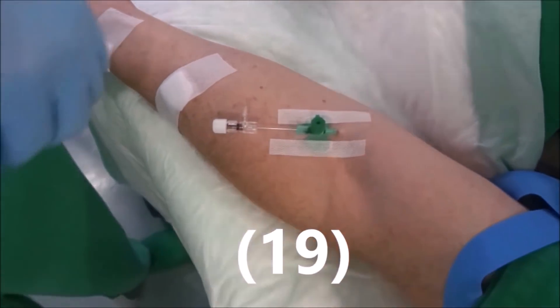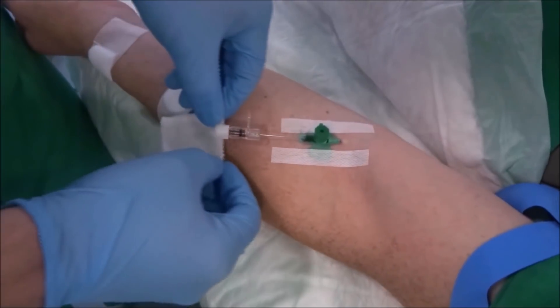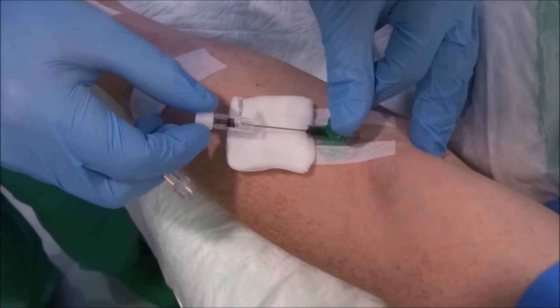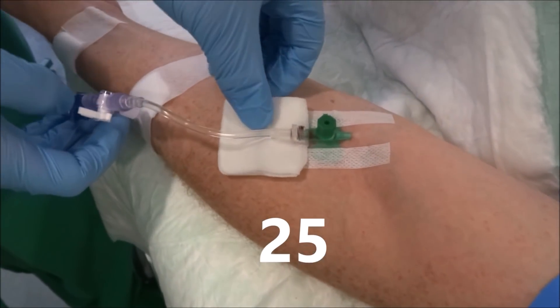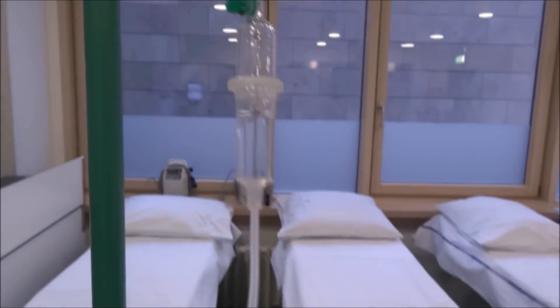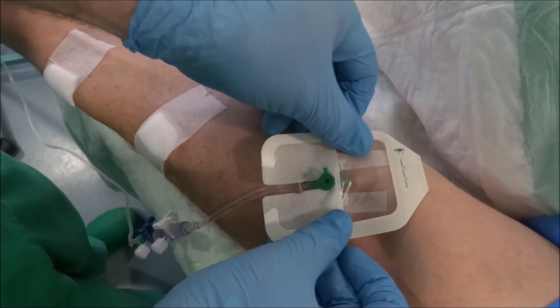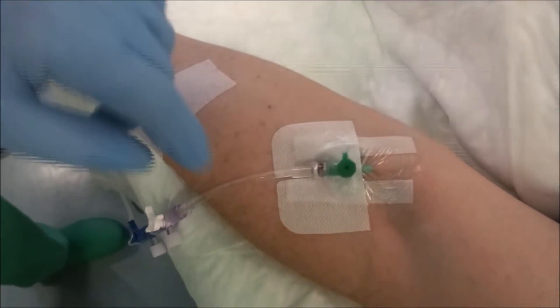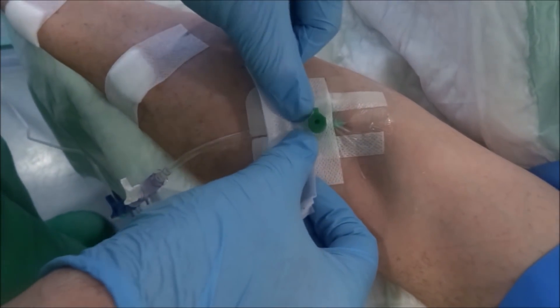As point 19, we would have to cover the puncture site with the transparent dressing, but this was skipped here. As point 20, we put a sterile compress under the catheter and compress the vein at the catheter end. We remove the introducer needle while holding the catheter firmly, then dispose the needle directly into the needle box. Point 24, we screw up the infusion. Point 25, we remove the sterile compress. The transparent dressing is placed, allowing observation of the puncture point. Point 26, we provide a secure catheter fixation with an additional adhesive strip or a splint or a bandage.